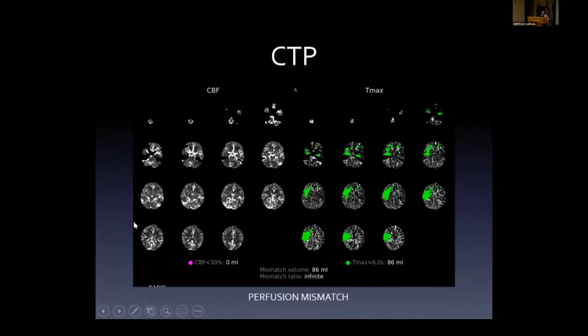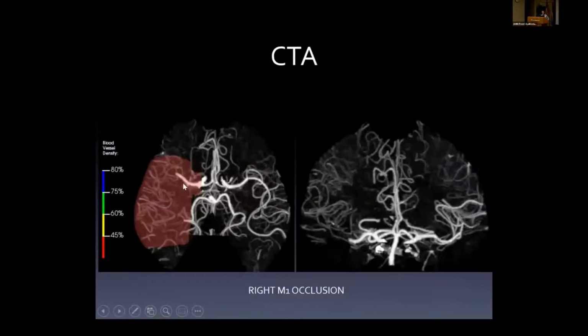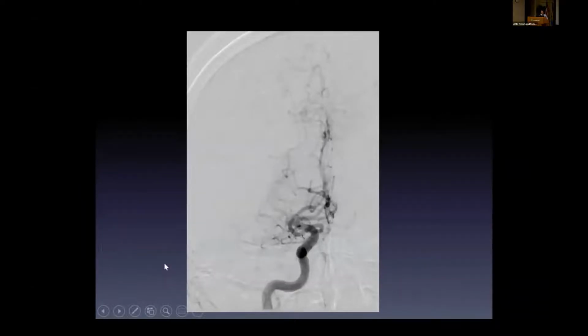So you can see here, based on this cerebral blood flow, there's really no evidence of a core infarct, but we can see that there is a region of penumbra, right? So there's a region that's at risk that has not yet infarcted. So again, when we did the CTA, we can see that there's an occlusion here at the distal M1 segment on the right. At angiography, again, you can see that there should be a vessel that comes out here. It should look like goalposts, and she's missing one side of the goalpost. And you can see this big empty area. You can also see those collaterals that we talked about as well.